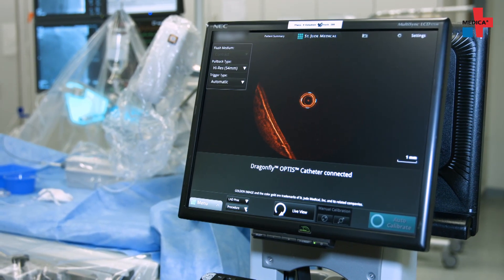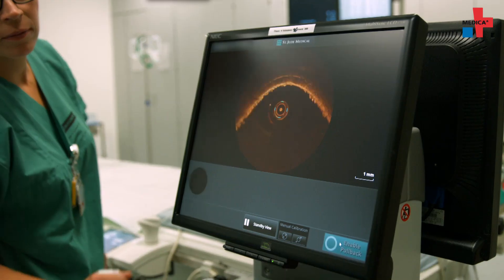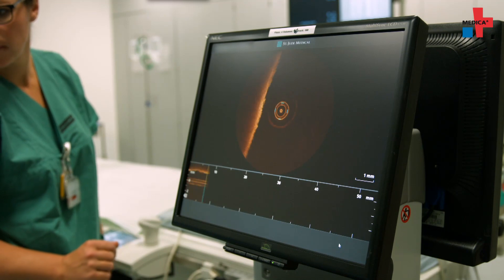We are already inside with the cardiac catheter and now only have to insert a tiny wire into the coronary blood vessel. The light source is inserted through this guide catheter. After three to five minutes, we have live infrared light images and are able to select the subsequent interventions and treatments.